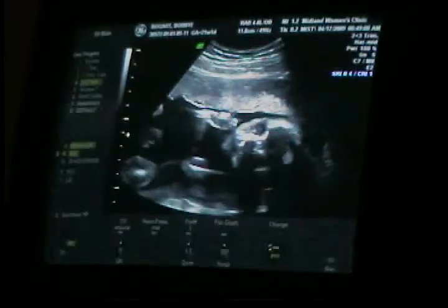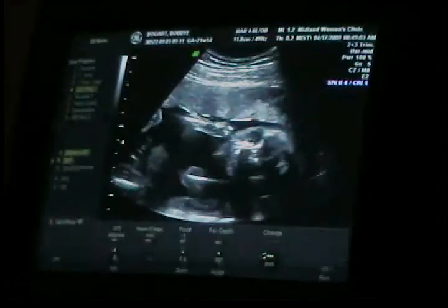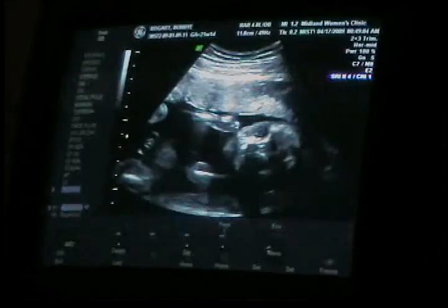That's our little face. There's an eye. You'll see his eye. Go into the eyeball.